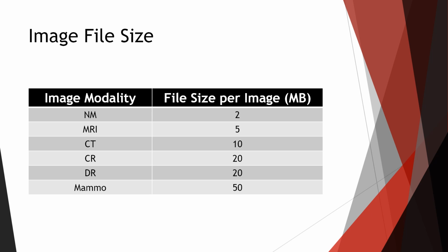This is just an example of some image sizes and why compression is necessary, because there's not enough storage for the PACS servers. If we store the whole image and reconstruct it in the lossless style, there should be no artifacting that occurs. In the lossy technique of compressing images, there could be artifacting.